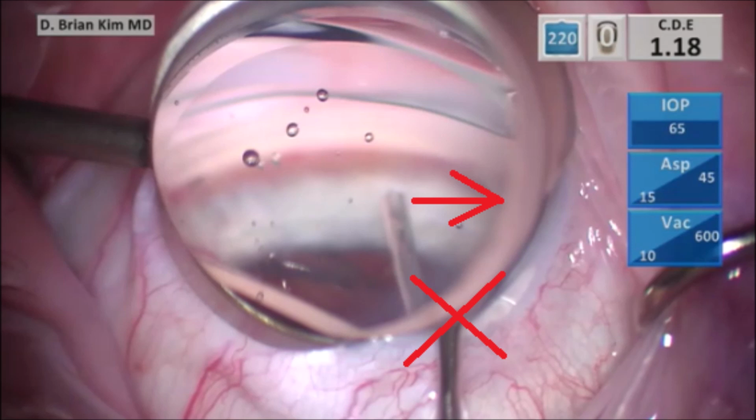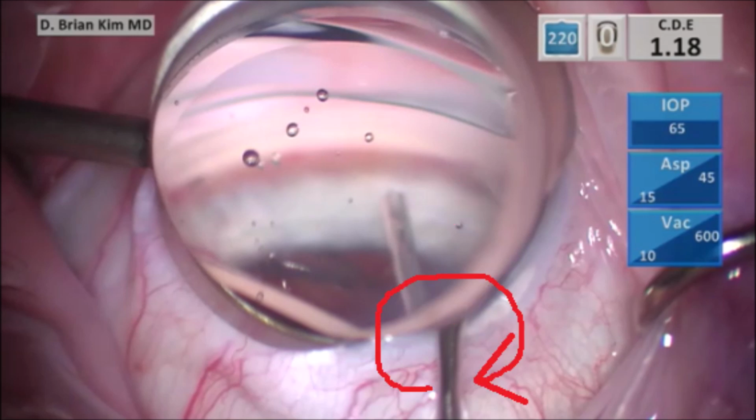You're going to be moving the eye as you're doing it. You're not going to have very good control and you're not going to be able to get a nice perpendicular approach towards the trabecular meshwork. So again, the key is not to have a translational movement, trying to get the shaft of the device towards the right side. Instead of a translational movement, it needs to be a rotational movement. And so no different from capsulorhexis, where we have to pivot within the incision in order to do the maneuvers, we have to pivot the device within the incision.